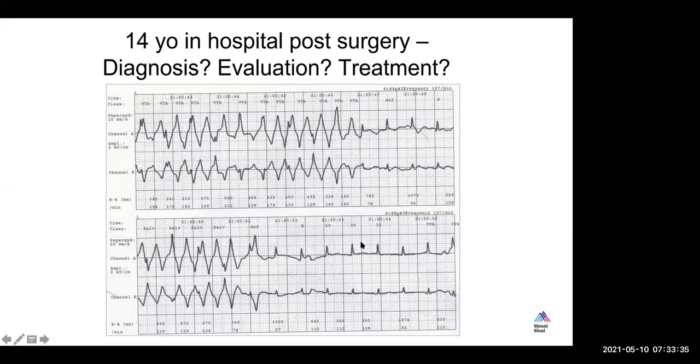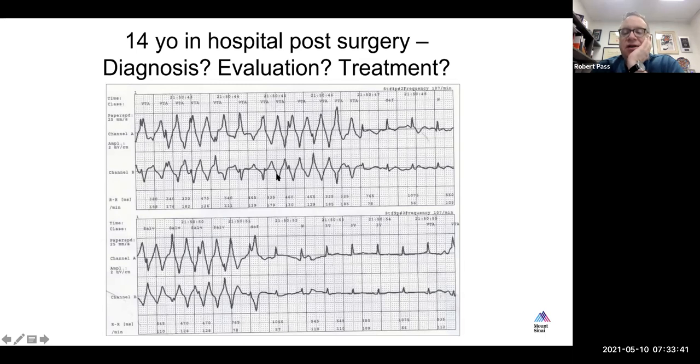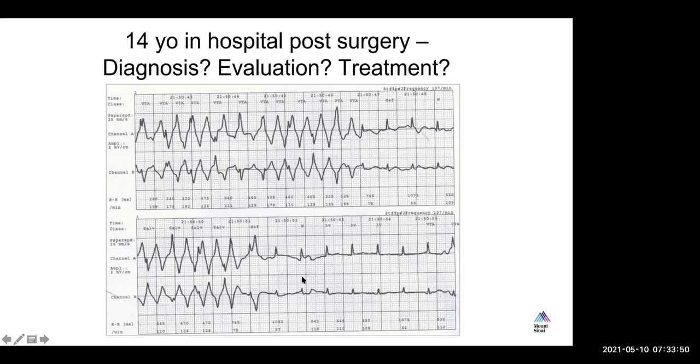On the second strip, is this a continuous strip, Dr. Parth? Yes, I believe it is. It goes from the top and then the bottom. They are not simultaneous, so okay, it's continuous. So we see the wide QRS morphology with a rate of about 170 and then it goes into a somewhat narrow complex, slower rate, and then we go back into that wide and then we come out of it again. Looking at the wide QRS strips, it seems to be some sort of ventricular rhythm. So I would say VTAC, but then I also see these deflections that are sort of suspicious.